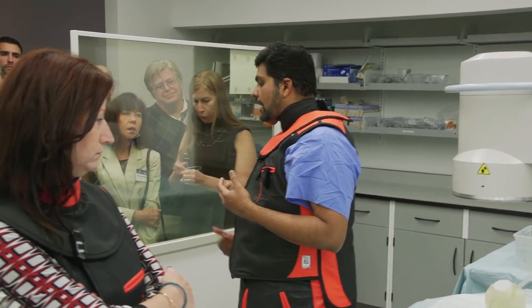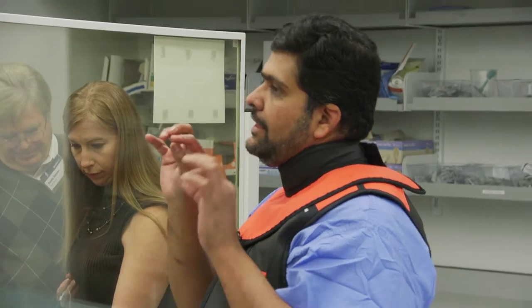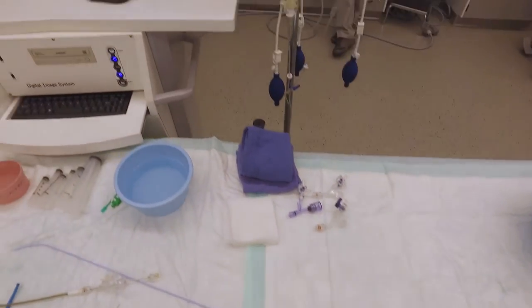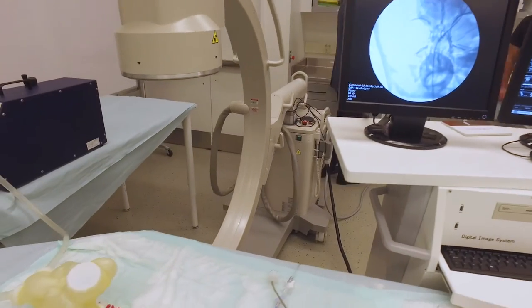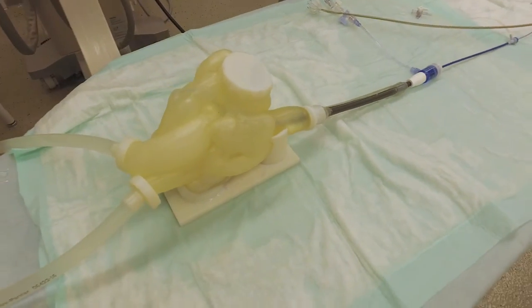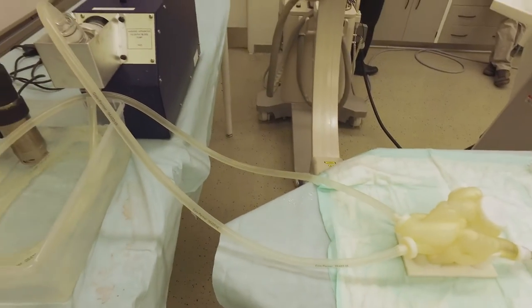You come from the IVC and go to the vein above the SVC, and then as you drag your sheath back, it first drops into the right atrium, and then it drops into the fossa, which is a thin portion of the septum. You teach people to look on fluoro and identify those two drops. We can actually show those two drops on a 3D model so they can get a sense of what we're talking about.